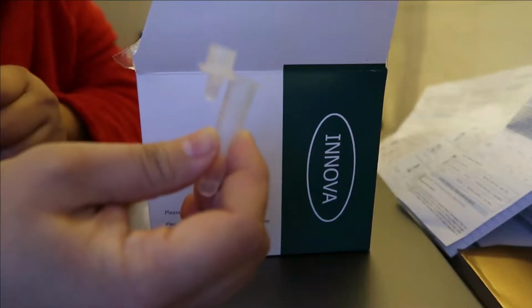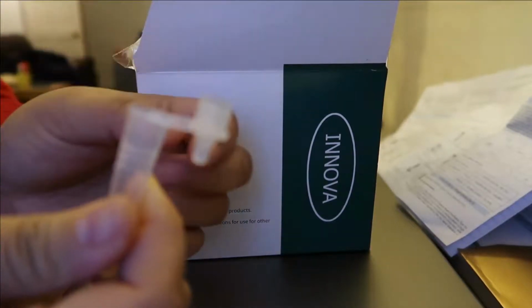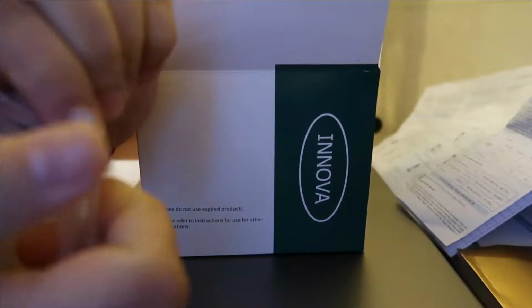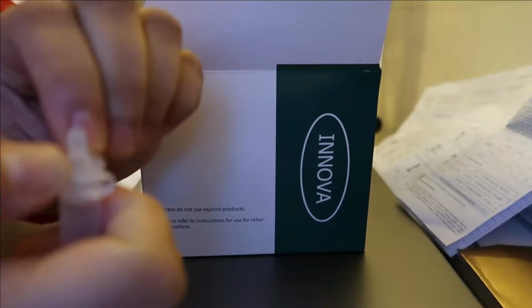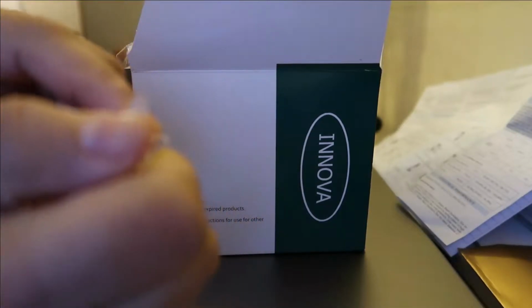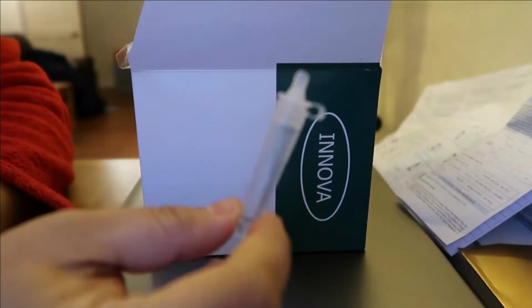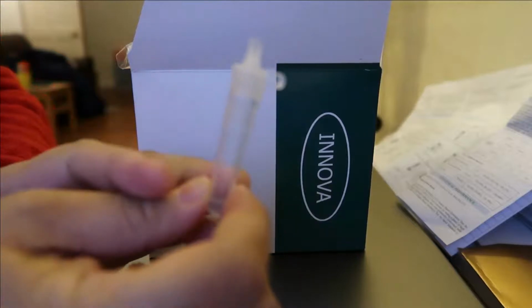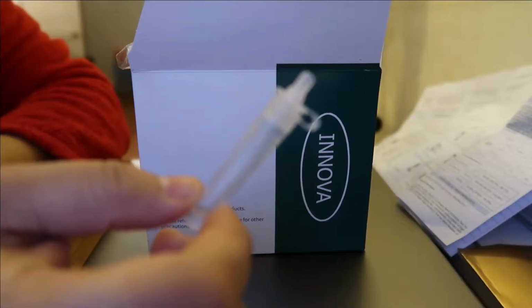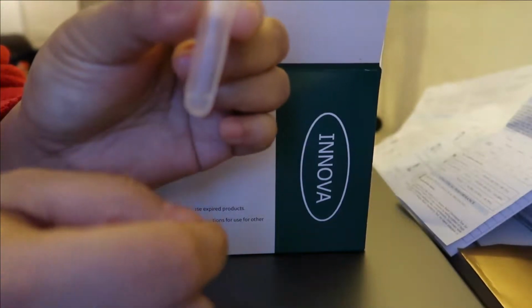Then, removing the swab, install the nozzle cup onto the extraction tube. So just flip it over and then press on the edge, not touching the tip of the nozzle cup. Okay, so it will look like this now. Notice that I never remove this from my hand. I did not put it on the table or anything, because I didn't want to tip off the liquid inside.